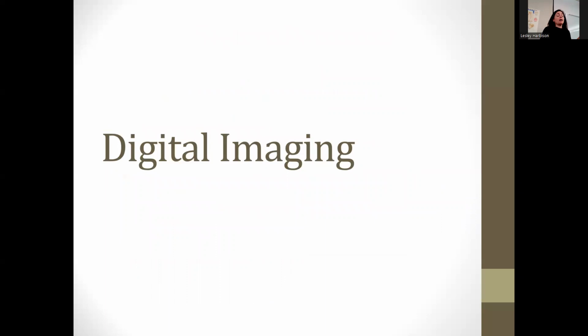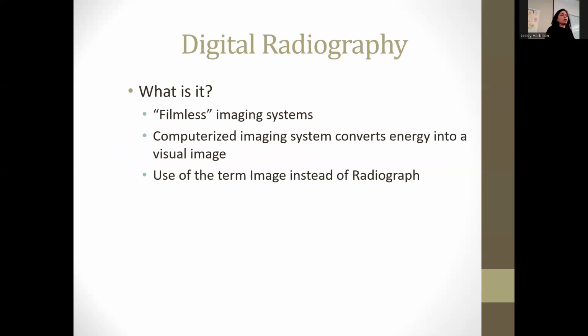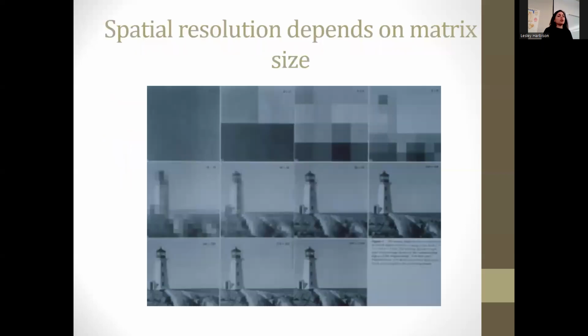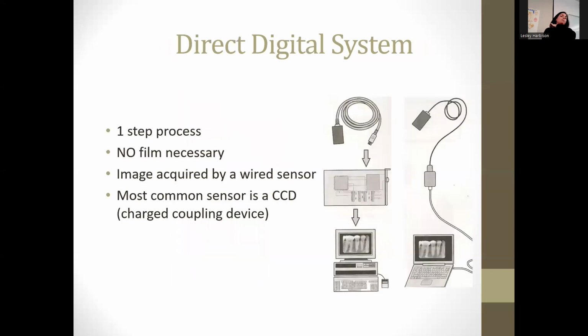Digital imaging, however, I probably have to figure out a way to talk about in a little bit more depth, and I didn't think today was necessarily the day, although if we get done with a half an hour to spare, I'm going to come back to this, because there are a few things with digital radiography that I do want to make sure you know. At this point, you have been working with it in lab, so you know many things about it, but there are a few things about how the image is captured and what the system is called that I just want to talk about. There are two main different types of systems, and I want to differentiate between them.